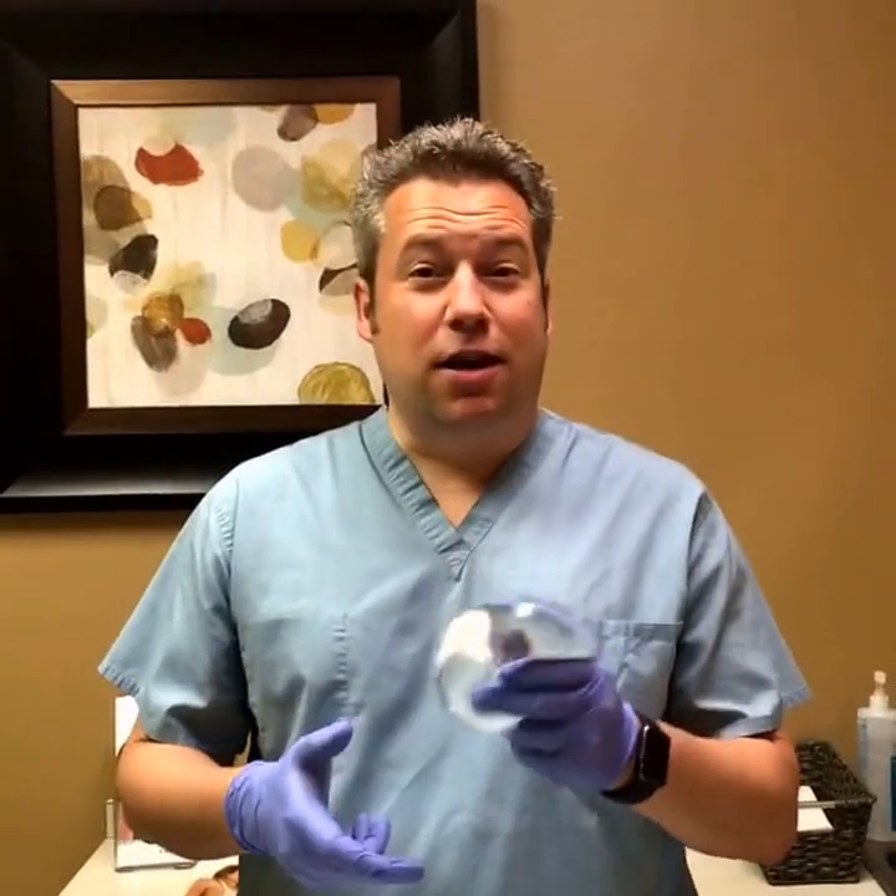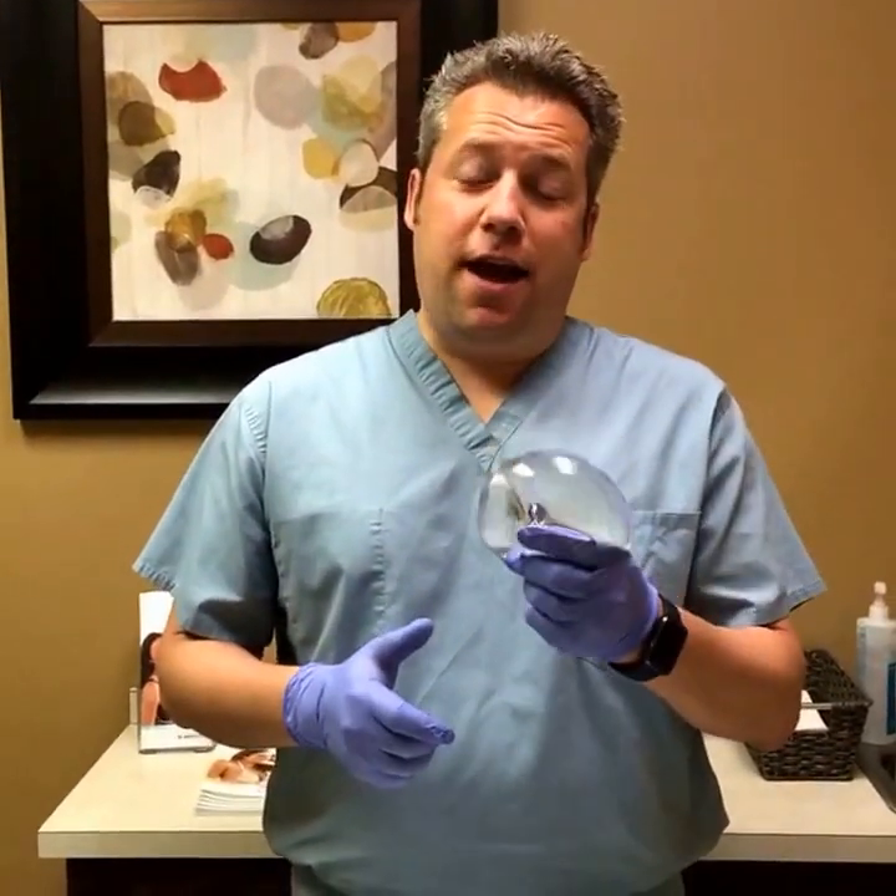Hey everybody, how you doing? Dr. Jason Petrangaro here. We are doing another in our series of Facebook Live videos today, and as we promised, I have a breast implant here in my hand and we're going to cut this thing in half.